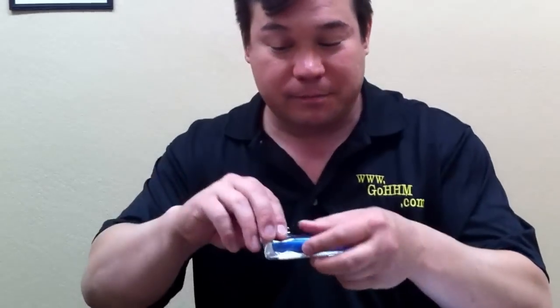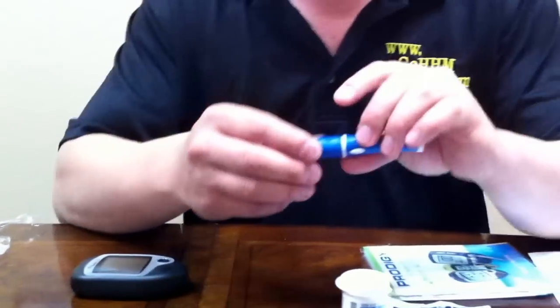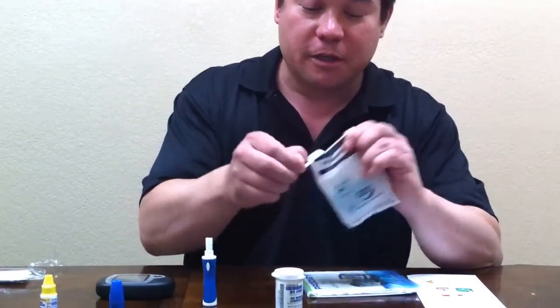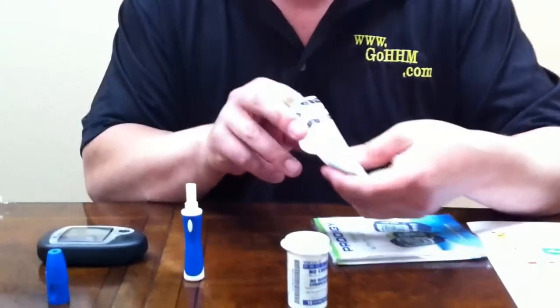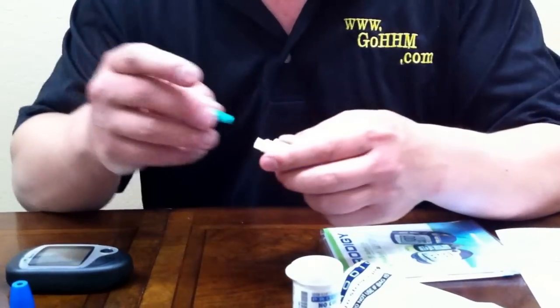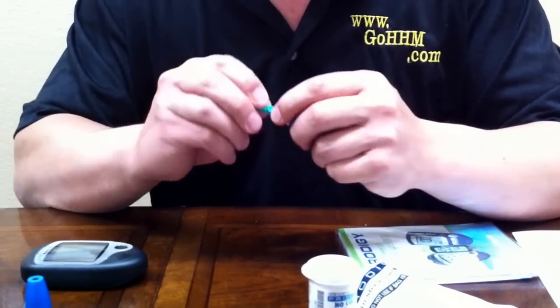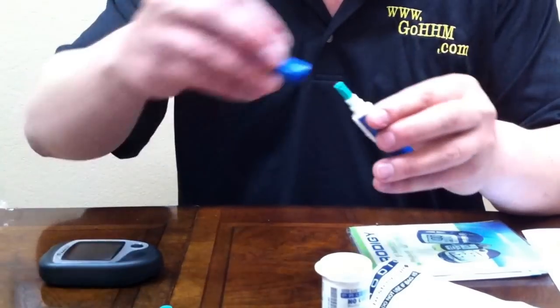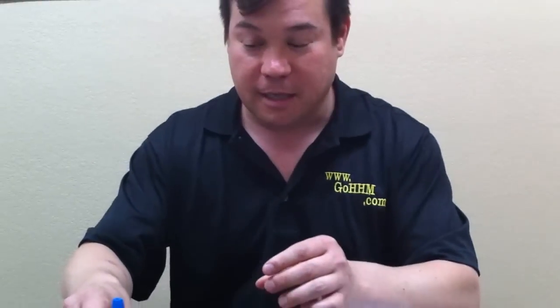Now your meter is set. Next up is your lancet injector. The lancet injector is used with your lancets to inject a small needle into your skin. This small needle is kind of scary for some folks, but a lot of folks with diabetes understand that they'd rather take this small needle a couple of times a day than have to take a needle into their stomach for their insulin. So we're going to place the lancet in there, twist off the top like so, put the lid back on the lancet injector, cock it back, and set that to the side.